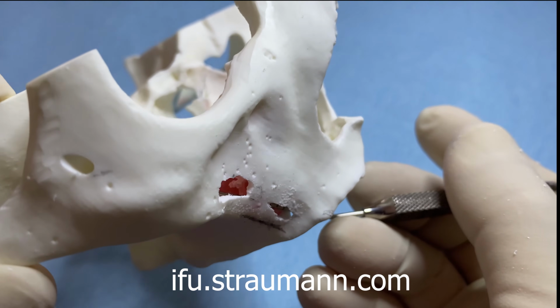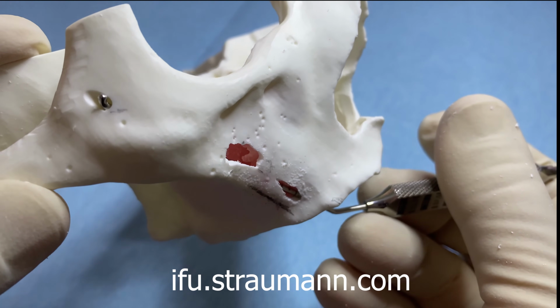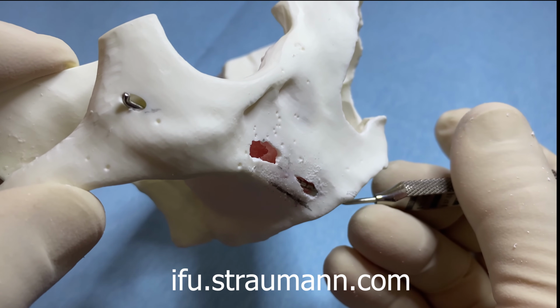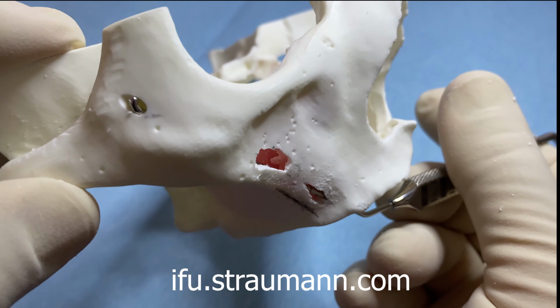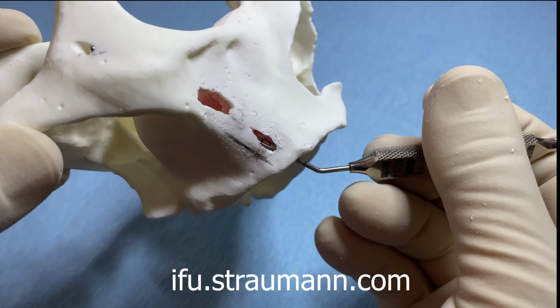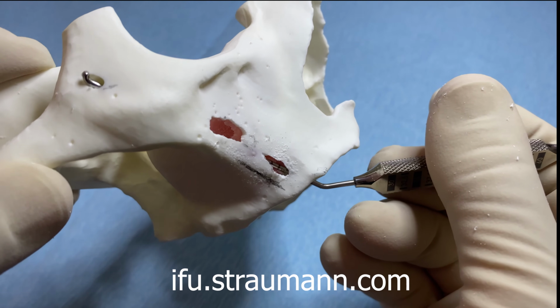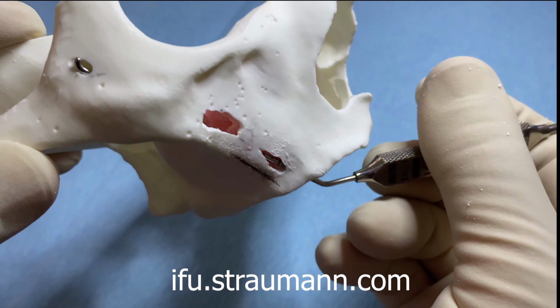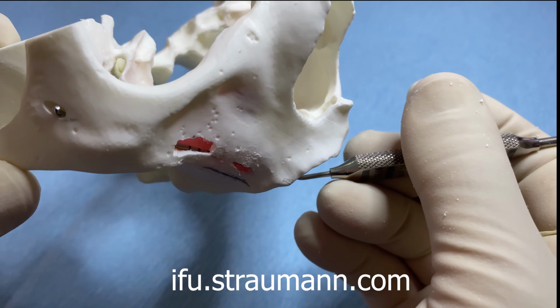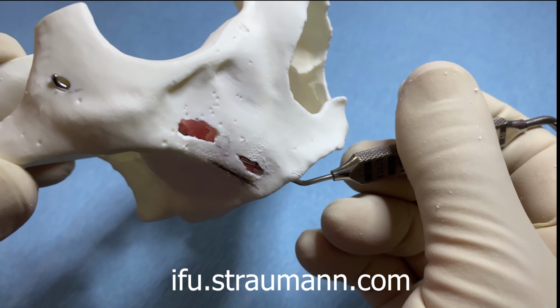Now, the apex is on a slope, so do we measure from the top of the slope, or do we measure from the bottom of the slope? It really makes no difference. This slope generally is about 2.5 millimeters long. It makes absolutely no difference if we measure from the top or from the bottom. But an implant cannot be predicted or pre-chosen just like an axial implant, because a slight variation in a starting point or the angle will make a difference in the length. So that's why we have to have all sizes available, and then at the time of surgery we choose it.